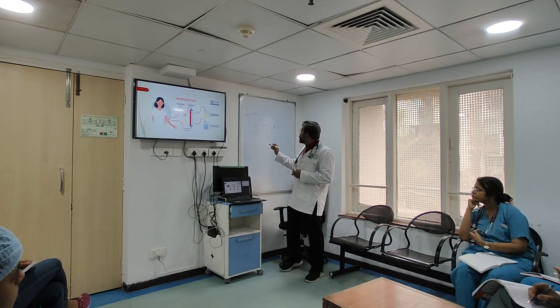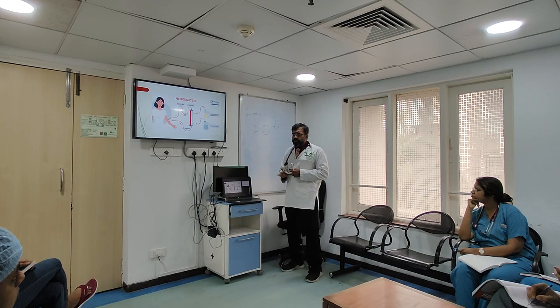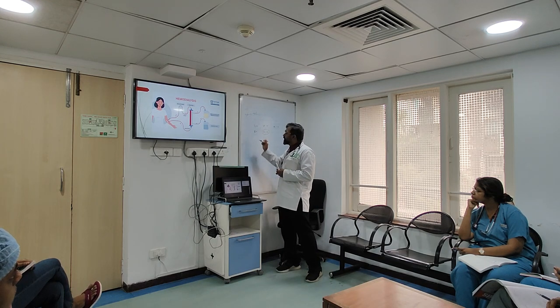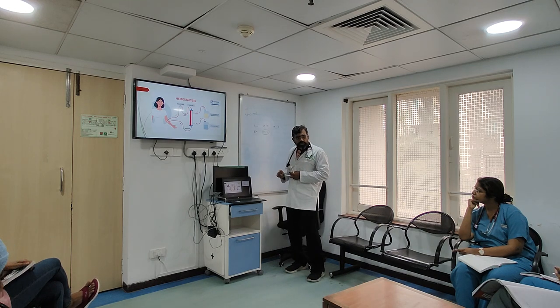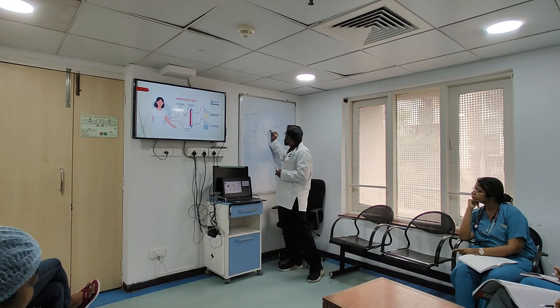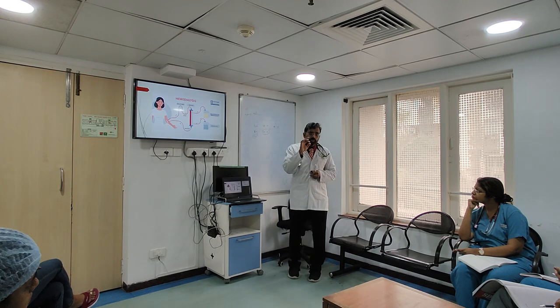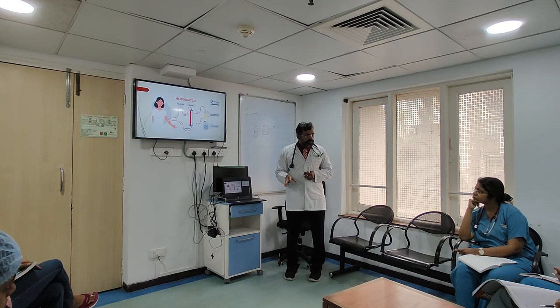Now what you do at 4 p.m. is you decide, let me make my UF 4 liters. Now it is around 4-5 p.m., and you have only around 1 hour left. Okay, now what happens when you do this? At 6 p.m. you're going to stop your dialysis. That means another 3 liters is going to go out in 1 hour. Any patient, you remove 3 liters in 1 hour, the patient will collapse.